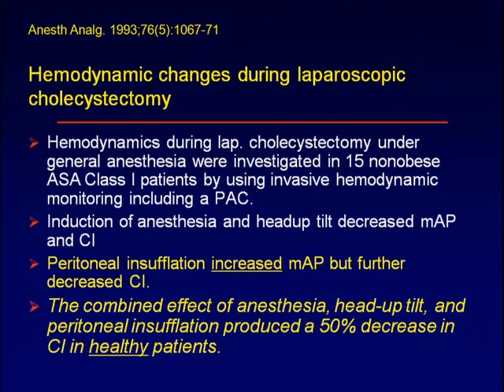And they found that peritoneal insufflation increased mean arterial pressure, but actually decreased cardiac index over what had occurred simply by the induction of anesthesia. And they then concluded that the combined effect of anesthesia, putting a patient in the head-up position, and insufflation of the abdomen produced a 50% decrease in cardiac index in healthy patients.